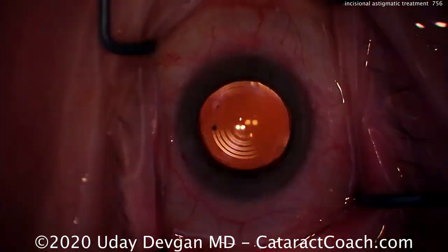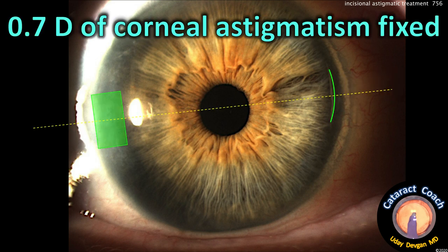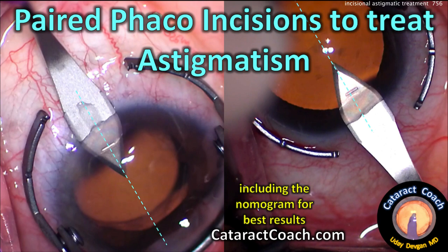We line it up exactly and place the LRI blade 500 microns deep, passing a small arc — that's all you need. At the end, check to make sure it's totally sealed and watertight. Post-op of the phaco incision plus the small limbal relaxing incision looks beautiful. It's comfortable for the patient; they don't feel it, it doesn't tear up the epithelium, and recovery is identical to regular cataract surgery. This patient had about 0.7 diopters of corneal astigmatism fixed nicely by just the phaco incision and the LRI. Here's a simple nomogram I learned from Kevin Miller 20 years ago: 500-micron depth blade, one clock hour of paired LRIs equals about 0.7 diopters.